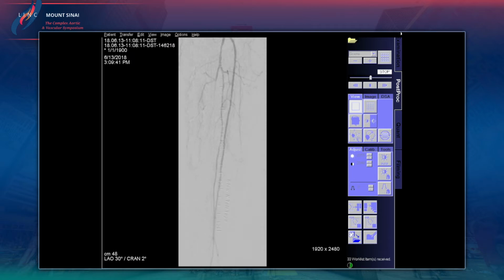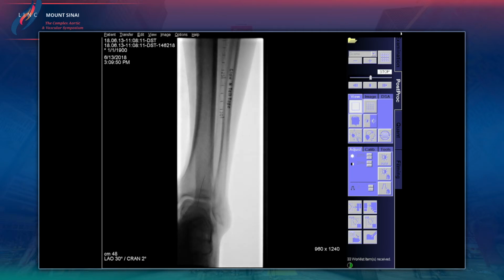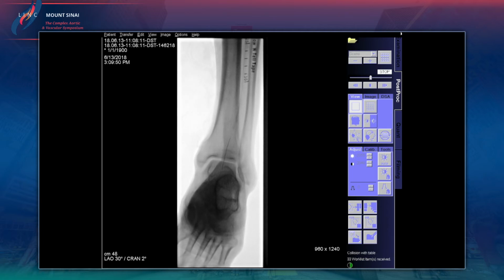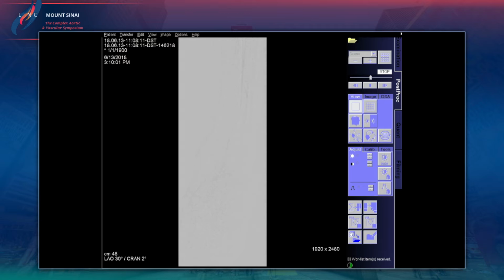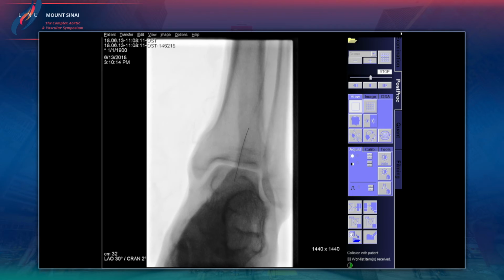Well, we have lysed a few, but we've gotten very good at dealing with thrombus through Penumbra and other aspiration as well. We do power pulse and then aspirate and are able to get away with it. But this is true thrombosis. And when you clean them out, do you not find that there was some sort of dissection? No, it looks beautiful. You take the clot out, it looks beautiful. It does. We're actually working on a series of our patients to submit, and that's what we're looking at right now. But it's an interesting issue.